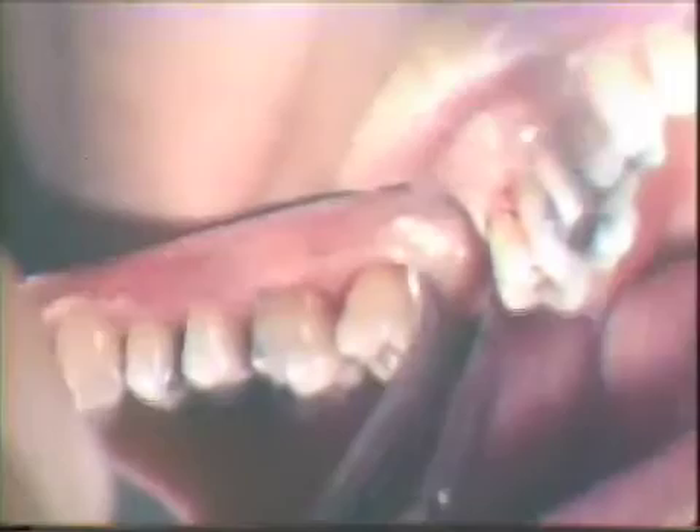Following local infiltration, a buccal incision is made parallel to the long axis of the teeth. The incision is kept close to the free gingival margin and directed toward the alveolar crest. A Bard-Parker number 12B blade is used. Care is observed to conserve as much of the interproximal papilla as possible and yet remove the epithelial pocket lining.